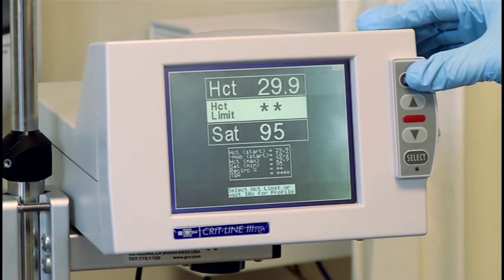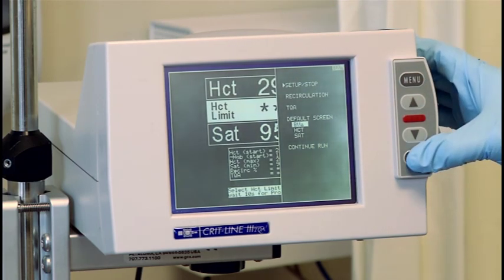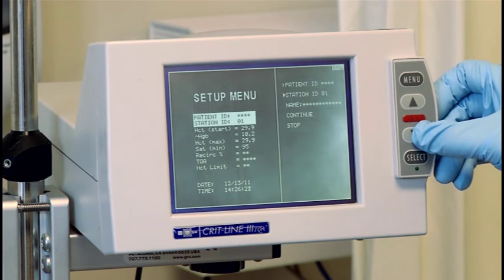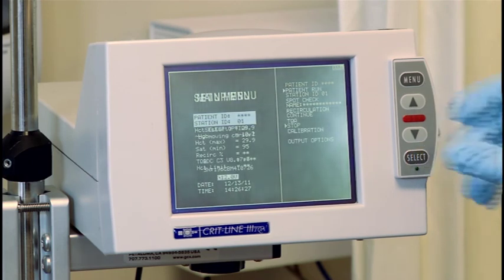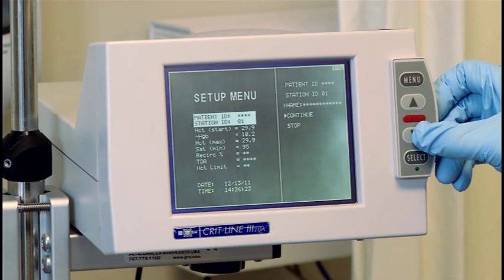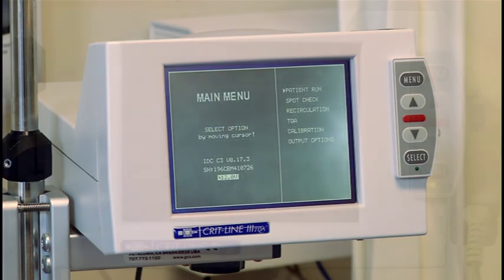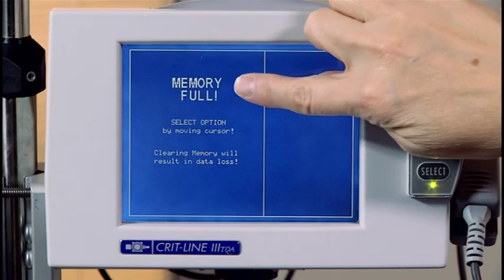In addition to changing the default profile screen, the split startup screen allows you to exit treatment by moving the cursor to setup stop and pressing the select button, which will direct you to the setup menu. Review the information in the setup menu and make any changes if desired. Then move the cursor to stop and press the select button to end the treatment. Once you select stop on the setup menu, the CRITLINE monitor will stop gathering data. A treatment session may also be ended by turning the CRITLINE monitor off. If you select stop from the setup menu, you will be directed back to the main menu where you can begin a new treatment. If you turn the CRITLINE monitor off and back on, you will see the memory full screen if you did not erase the memory from a previous treatment.